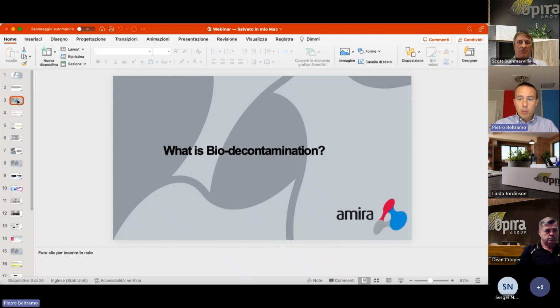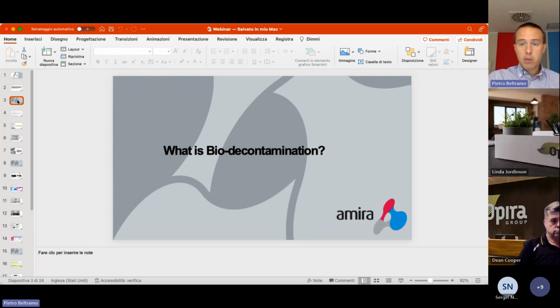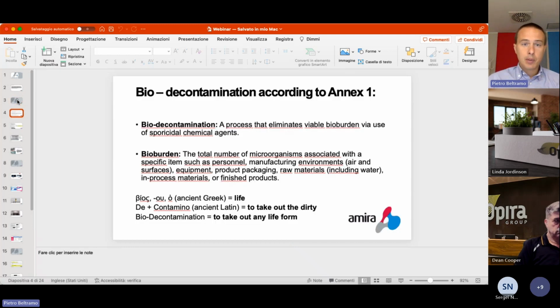And we would start with a very good question: what is biodecontamination? I would like to give you some tips and advice exactly on this topic. So it's good to put some common bases in understanding what the meaning of this word is. To do that, I will start from the latest regulation, especially in the aseptic pharmaceutical field, that is Annex 1 to the GMP. Annex 1 to the GMP regulates aseptic production in Europe, but it's a regulation that is recognized worldwide to be the gold standard for aseptic production.